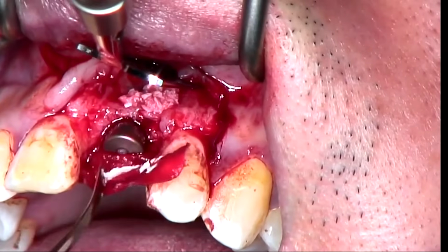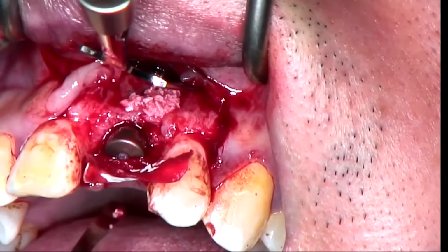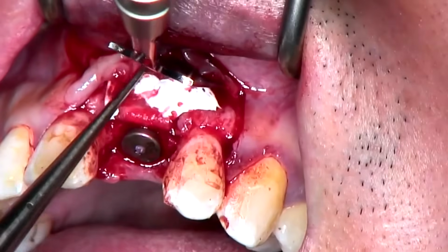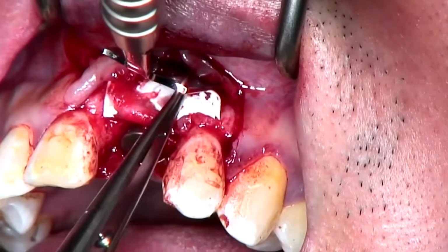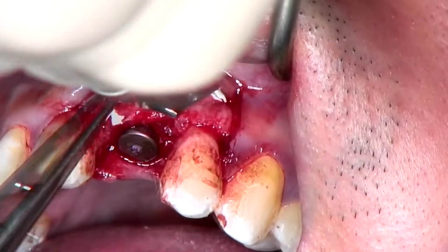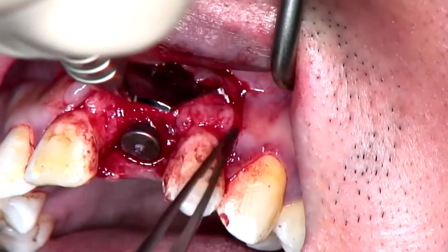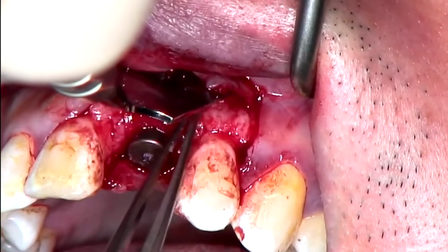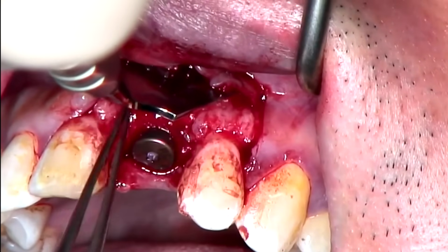After the membrane is stabilized, a bovine xenograft is gently placed in the bone defect. Once the desired morphology of the bone is achieved, the membrane is flipped back under the buccal flap in order to completely isolate the regenerated area.